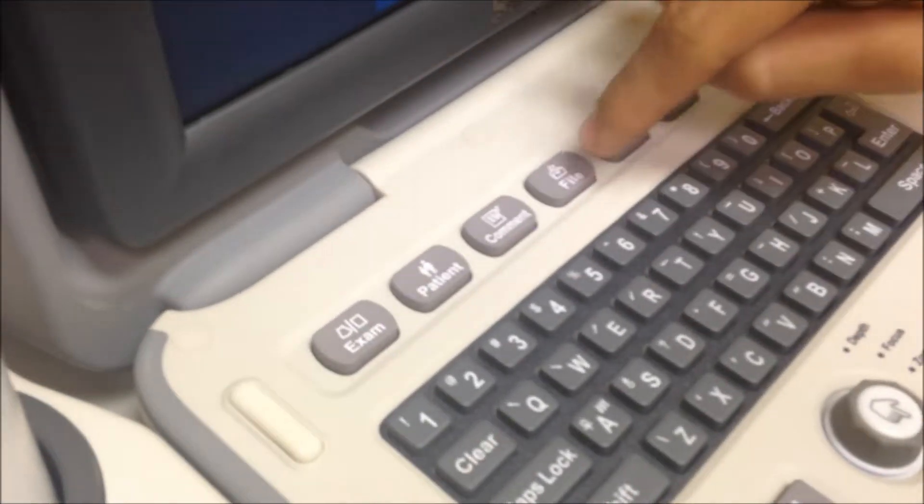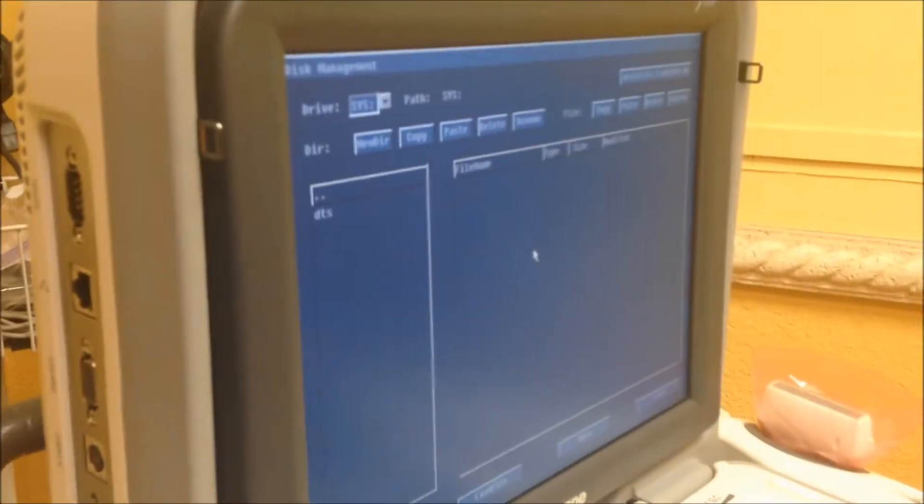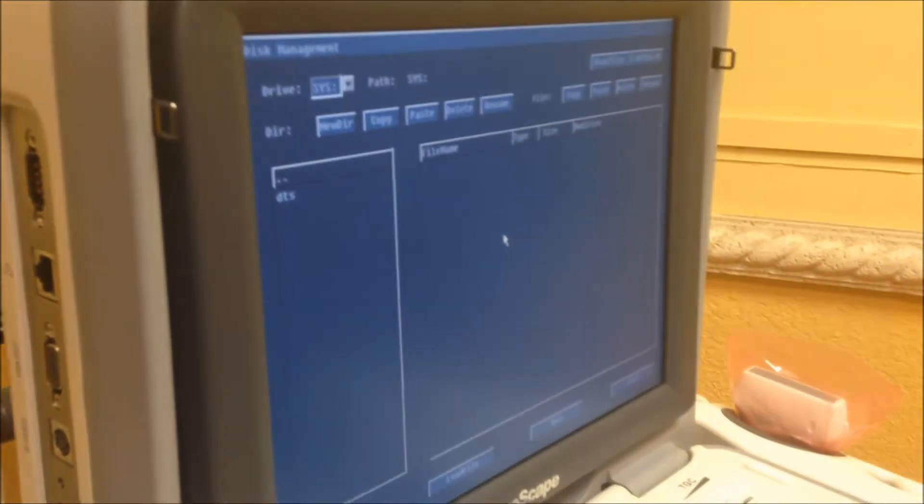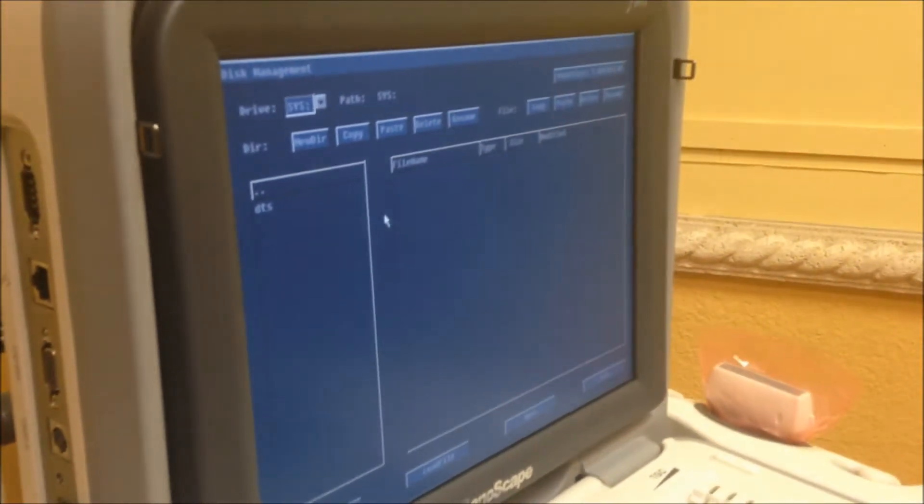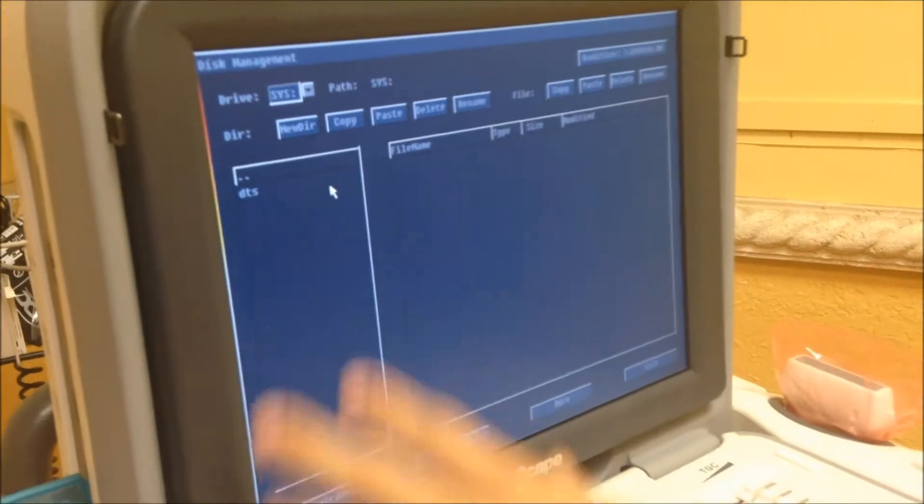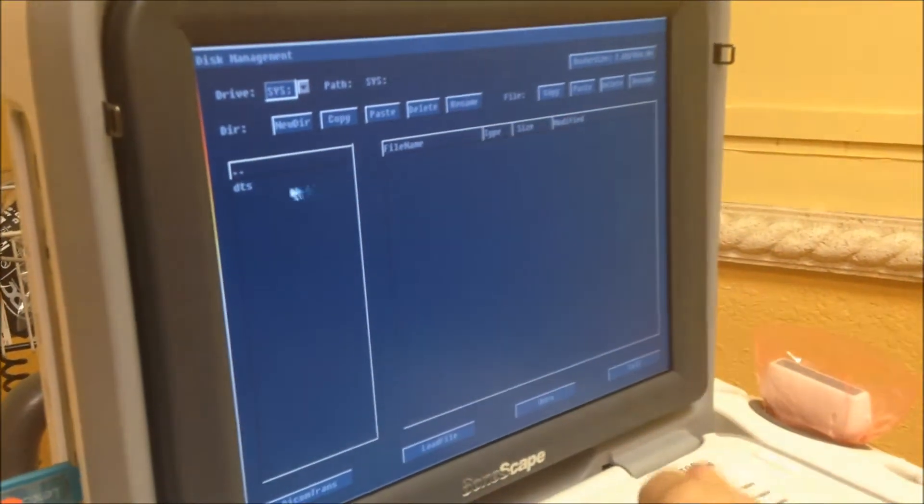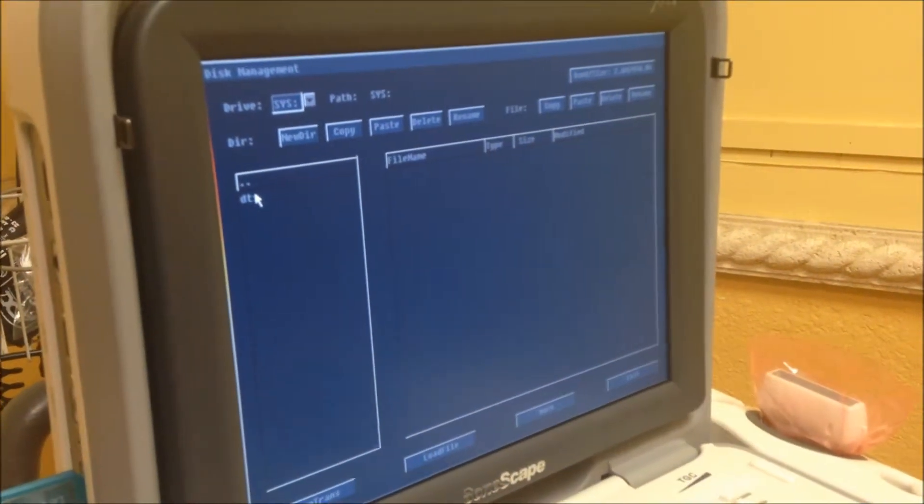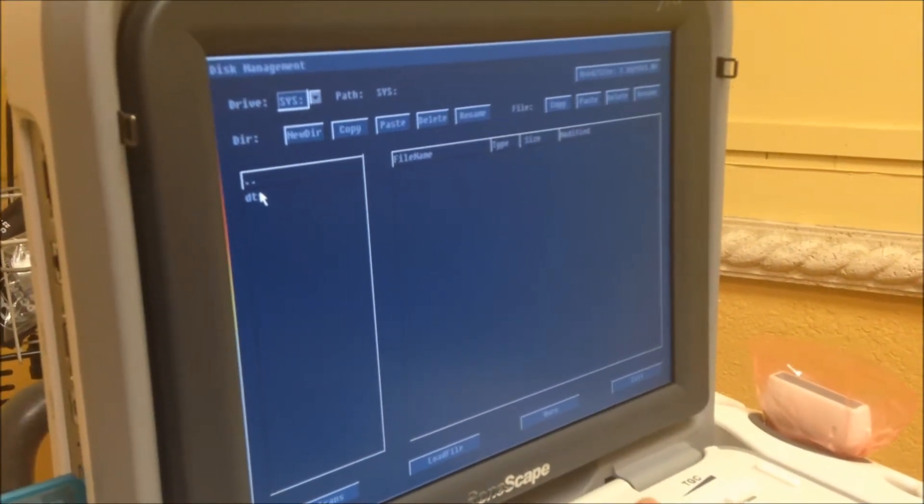And this is going to come up. This is your system directory. This is where all your patients are going to be. Of course, this is a new system, so it's only the test that I just did now.